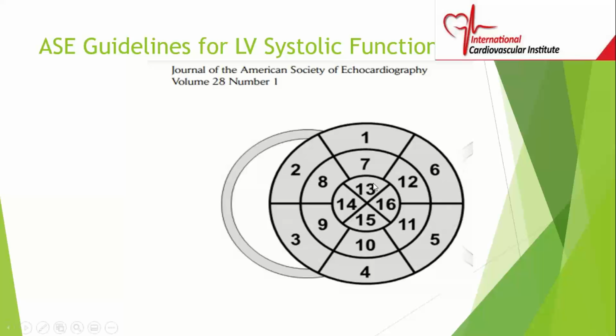So again, the inner circle is the apex. The mid segment is just outside of that, at the level of the papillary muscle. Then just outside of that, we have the basal segment at the level of the mitral valve. So how do we name these segments? Relatively simple. If we take the base at the mitral valve level, the uppermost segment is the anterior segment.